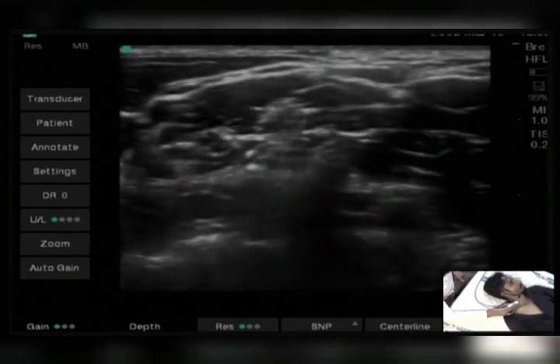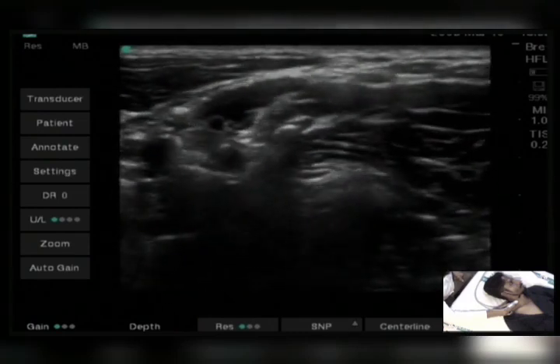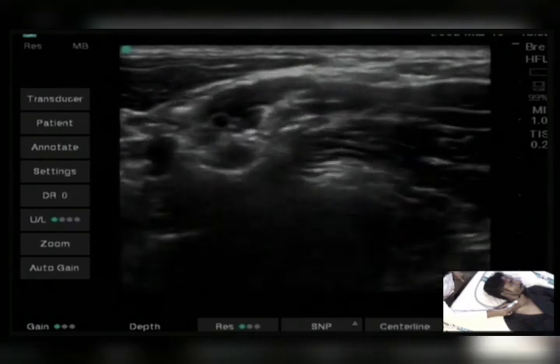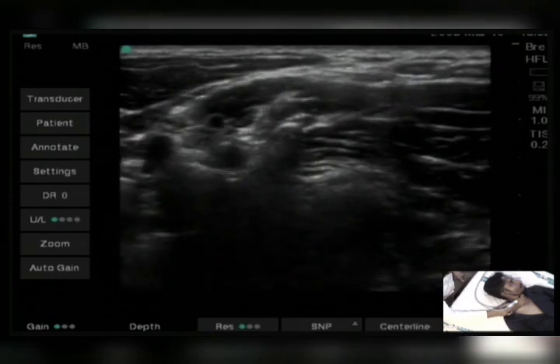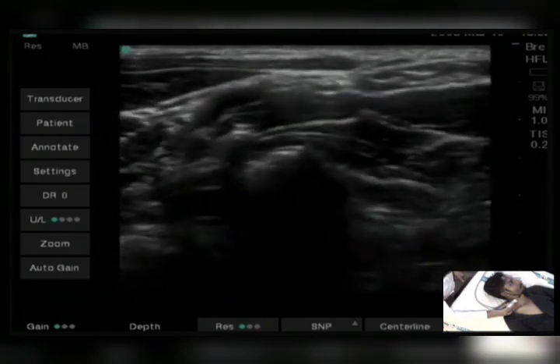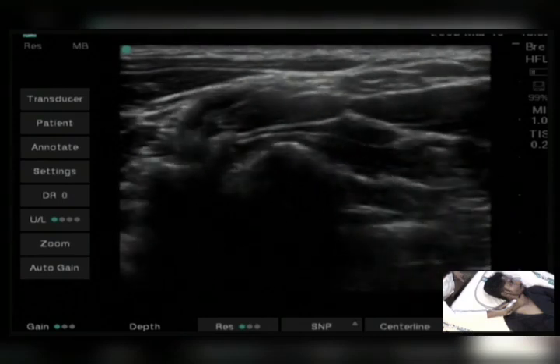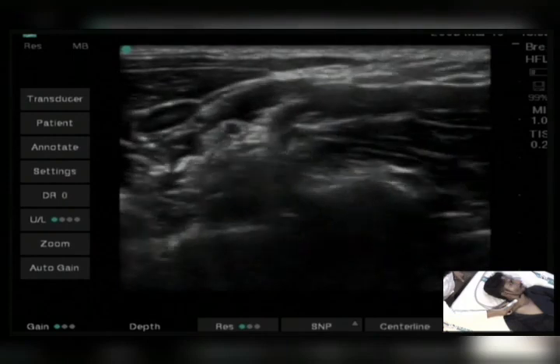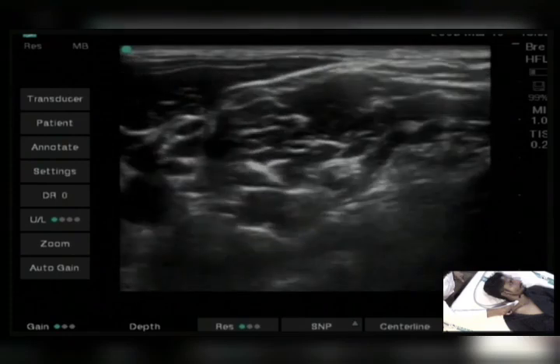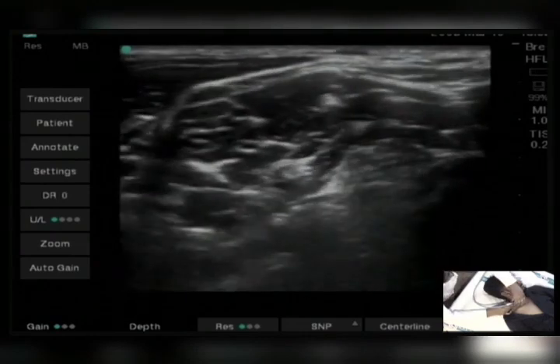When we go upward, the C6 will appear over here, and it has two tubercles, anterior and posterior. Okay, this is C6. And this is C5. Again, it has two tubercles, and so this is C5. So this is C5, C6, dorsal scapular artery, and C7.